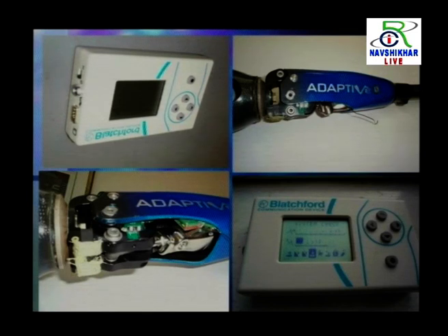In all three systems, there is automatic programming. The patient can program it himself, or it is programmed by a prosthetist. A qualified prosthetist programs the knee according to the patient's needs. In all these types of prosthesis, the motion is cadence dependent. For example, in adaptive, the motion is programmed in slow, medium, fast modes. Slow, medium, medium fast. So five modes of operation are there, and the patient can change from one mode to another, and within seven steps the prosthesis works according to the patient's instruction. So it is called cadence dependent motion.